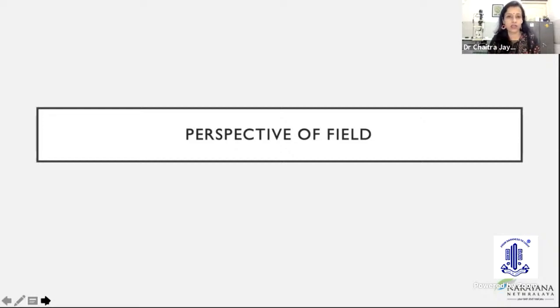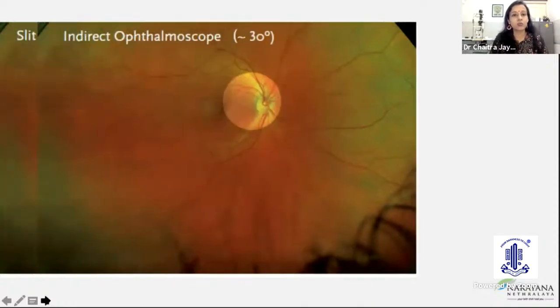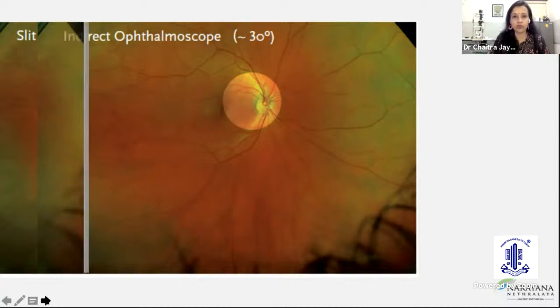practice, which a lot of anterior segment people would relate with. So this is your slit lamp with a 90 diopter lens. This is how much we see, and most of our glaucoma colleagues will well understand what I'm talking about. Next would be our indirect ophthalmoscope. We just see about 30 degrees. So imagine when you have to look at 200 degrees, you have to steer the eye, you have to steer the patient, you have to steer yourself, the lens and everything. And it's never visible in one view.